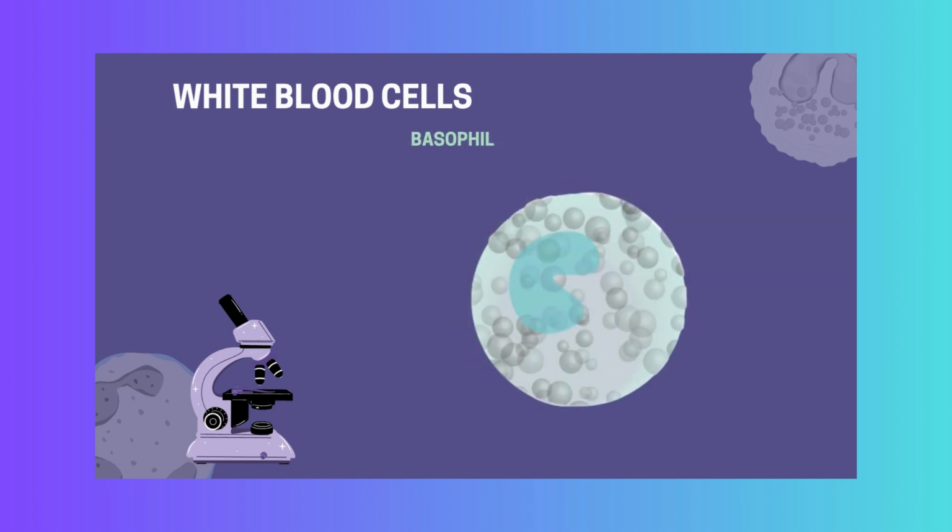Basophils are medium in size and, like eosinophils, are a granulocyte. They contain large granules that stain purple. Basophils may also have a bi-lobed or irregularly shaped nucleus, which can sometimes be obscured by the granules.